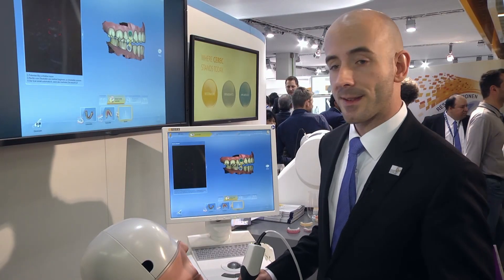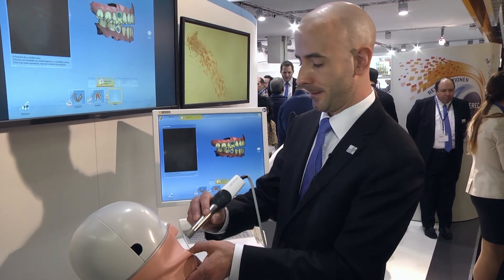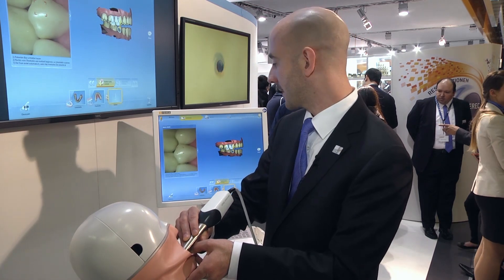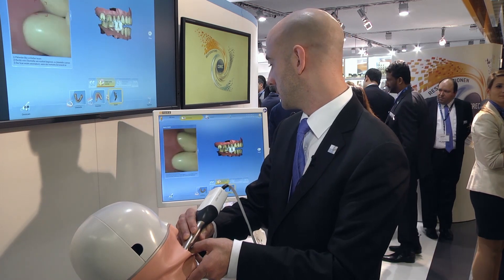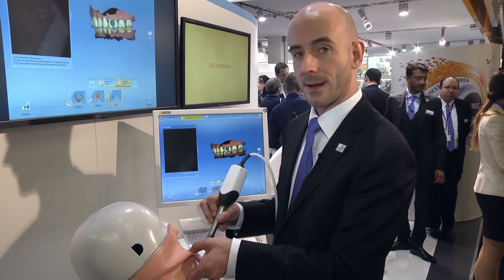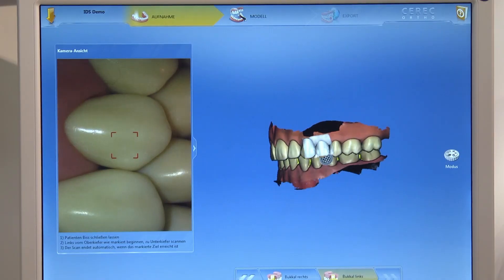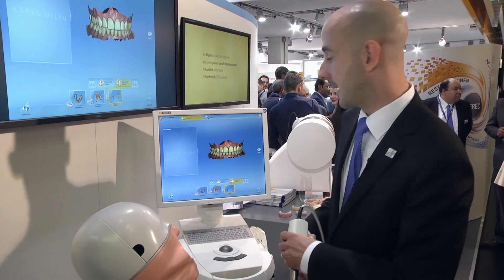Once we have both jaws scanned completely, we're ready to take the bite impression. We have the patient bite down naturally, just place the camera over the upper and scan down toward the lower. The software automatically recognizes the position. We take this scan from the right and then again from the left. And we're done scanning.